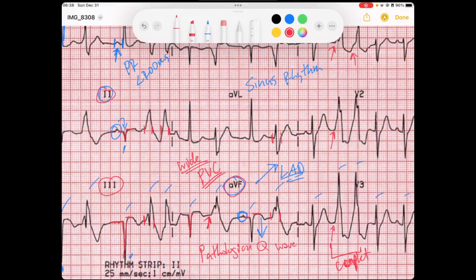Pathological Q waves occur when ventricular depolarization is moving away from that region because there has been a previous MI and that tissue is now fibrotic — it's dead, unable to conduct signal — so you get the signal going away from it.